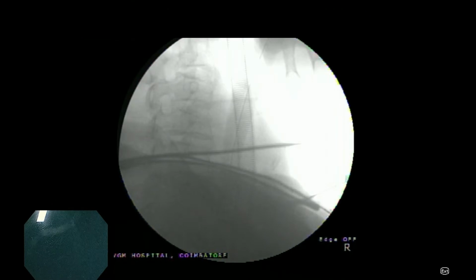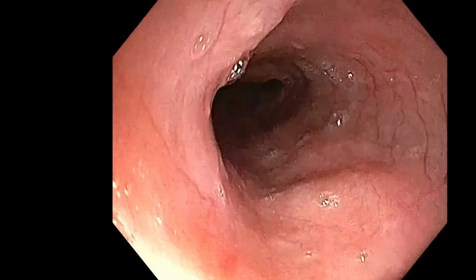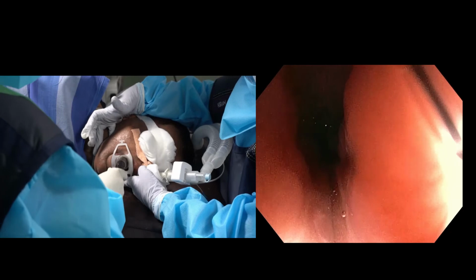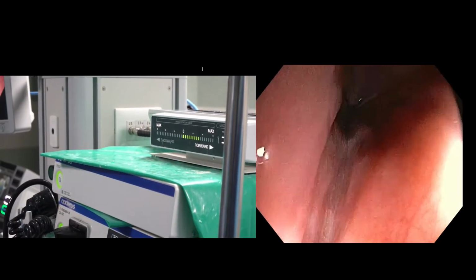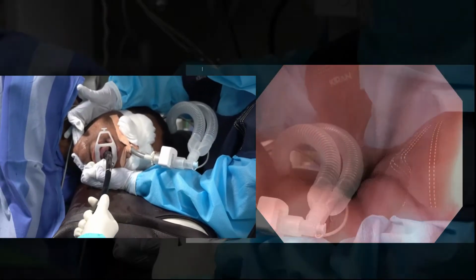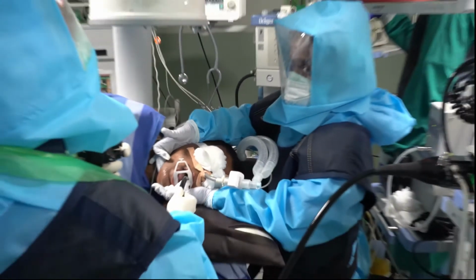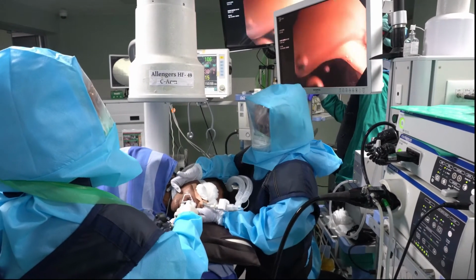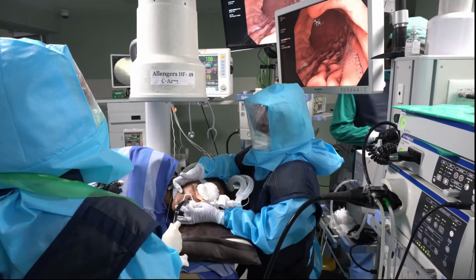Nasotracheal endotracheal tube is preferred as the orotracheal hinders spiral rotation. I enter. Now, at this point, I feel a resistance as the spiral segment reaches the cricopharynx. With gentle neck extension and pressing the forward pedal, I can advance. I continue to press the forward pedal as the scope traverses the stomach. Minimal water and carbon dioxide usage help the pleating movement.